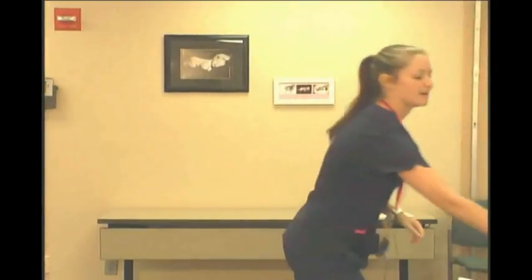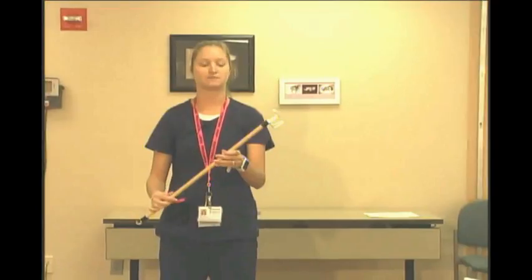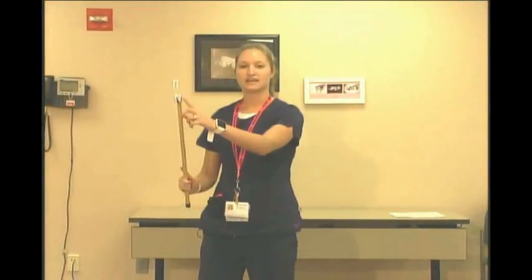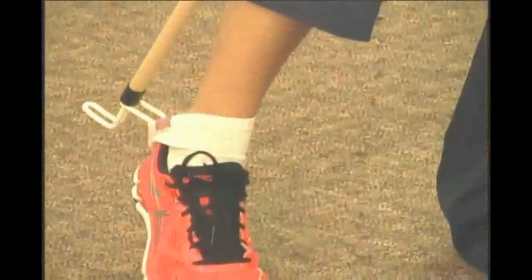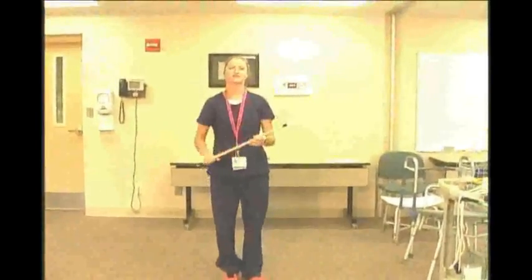Now let's talk about how to get them off. We use what is called a dressing stick. It's kind of a wooden dowel with a funny little prong on the end. We use the end, and we hook onto the sock at the bottom, and you'll push down. Let's see if I'm wearing high enough socks. So you'll push down off and past your heel. Of course, with my tennis shoes, it won't work too well, but you get the idea. It slides down and off your foot.